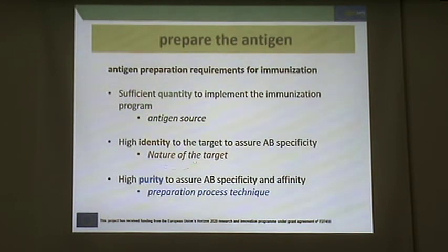The identity is important because it determines the antibody specificity, and then also depends on the nature of the target. And then we have the purity of the antigen preparation, which again generates the specificity and the affinity of the antibody.